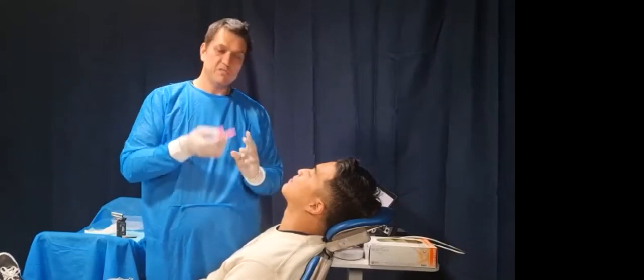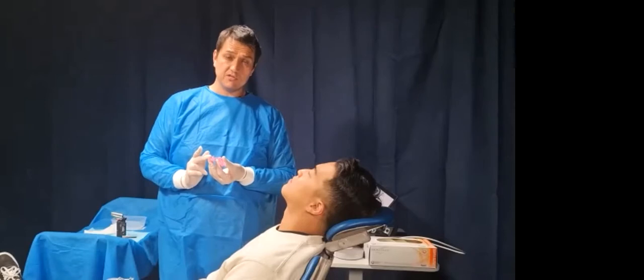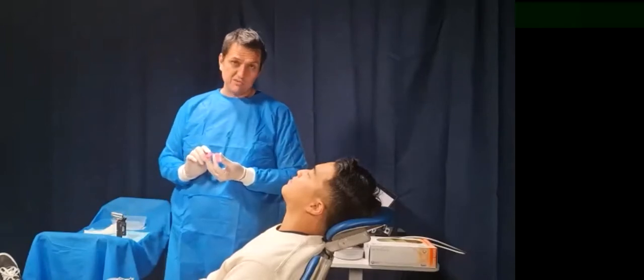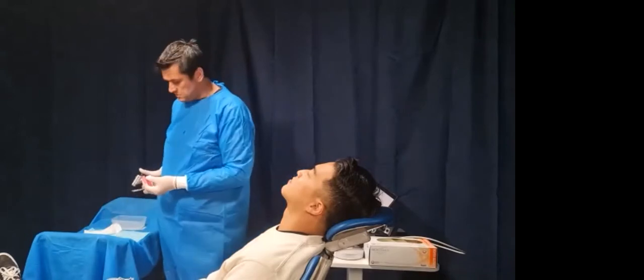So now this is what I got. I got wax everywhere. That's okay. What I traditionally would do now is seal the edges of the wax with my little wax knife here. I'd heat that up in a flame and seal that all together. Then what we'll do, and I'll show you, well, we might as well do it, hey? We're going to do this properly.